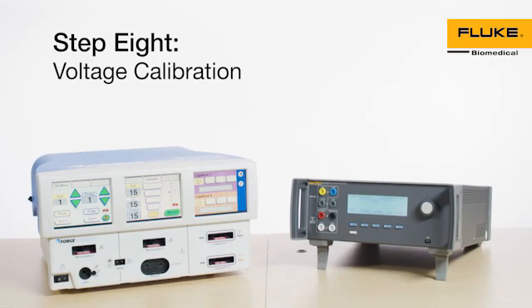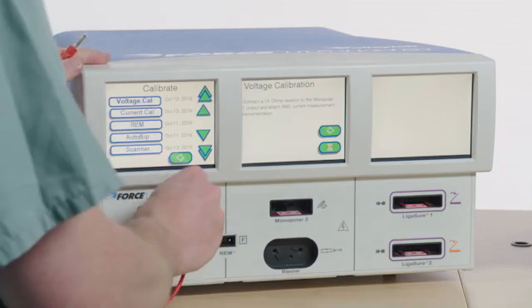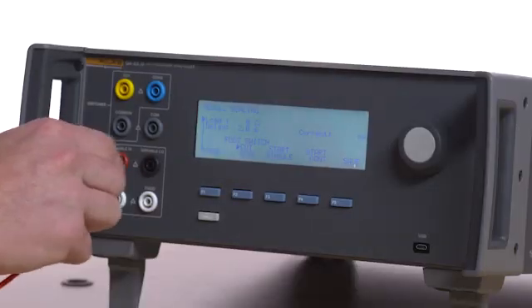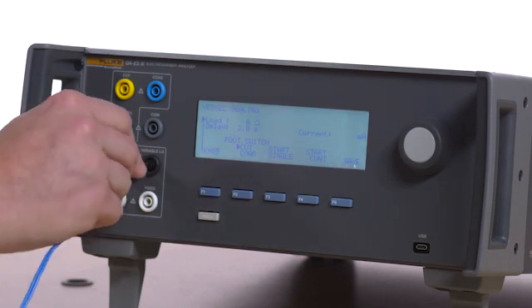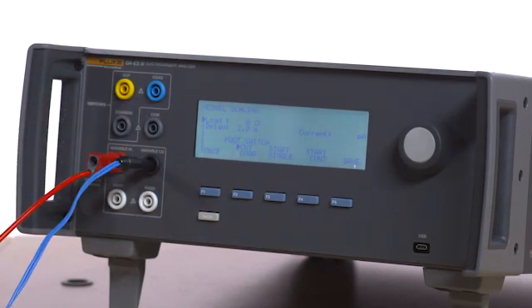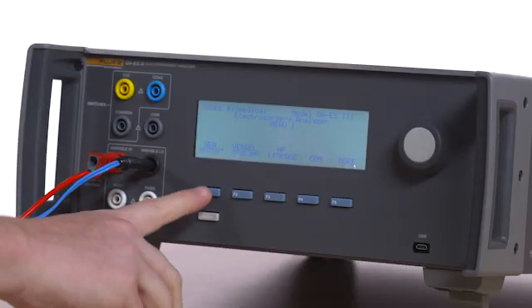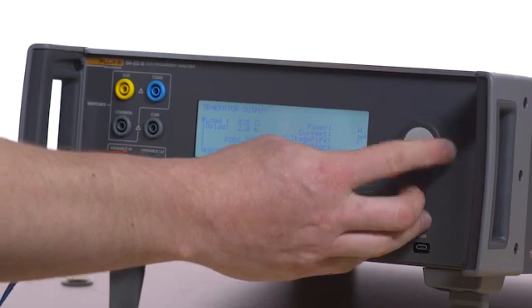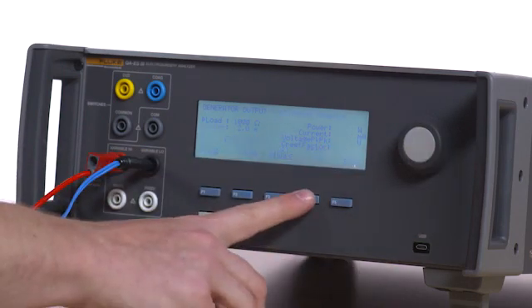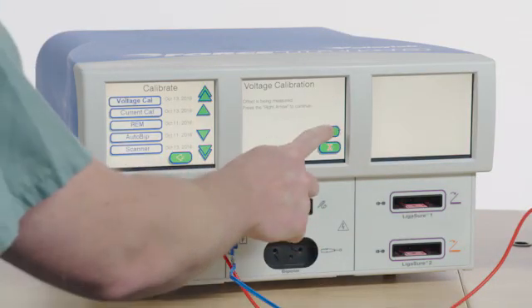Step 8: Voltage Calibration. Select Voltage Calibration from the Calibrate menu on the Force Triad. Connect a red cable from the rightmost input jack of the monopolar port of the Force Triad to the variable high on the QAES-3. Connect the ESU dispersive safety lead to the variable low port on the QAES-3 and then to the REM port on the Force Triad. Click the QAES-3 back button and then press F1 for generator output. Select 1000 ohm load and then F4 for start continuous. Follow the on-screen instructions to calibrate with 1000 ohms.